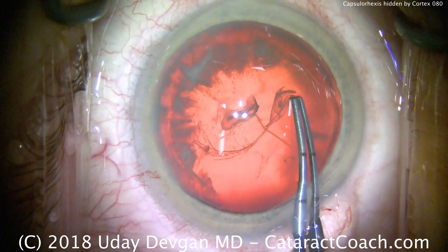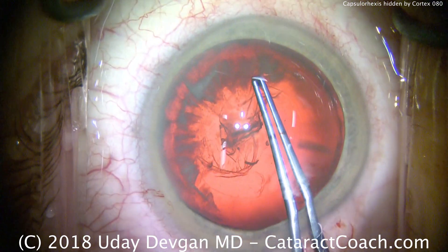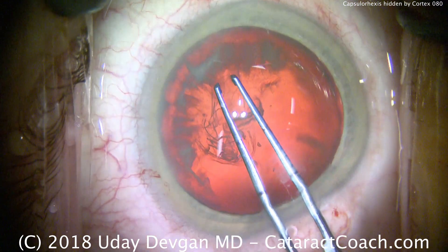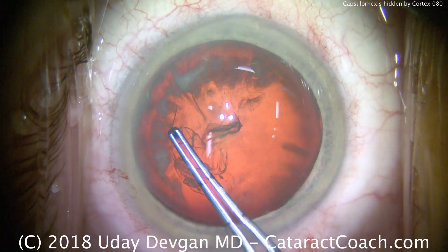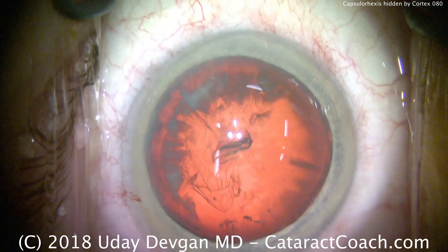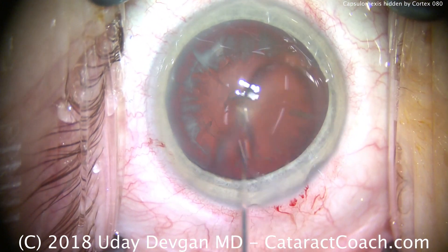We continue holding the forceps and bringing the rhexis around. Now watch carefully: we'll take the rhexis and stop only when I can see where I've left it. In between those spikes of cortex, that's where you can let go of the lens capsule and then be able to see it to re-grab it.